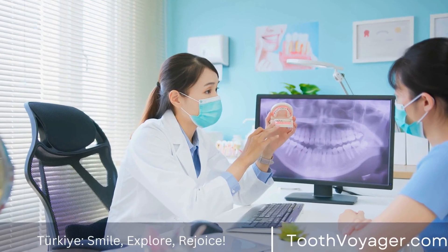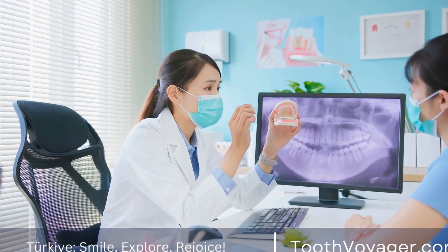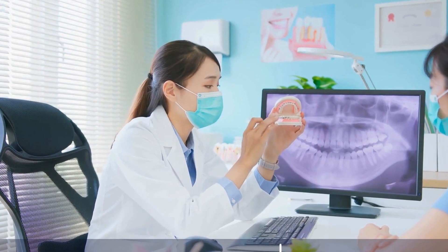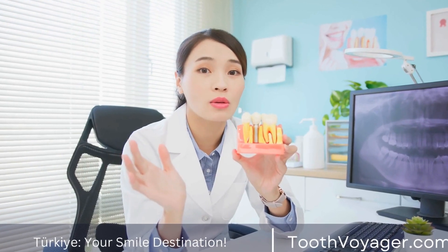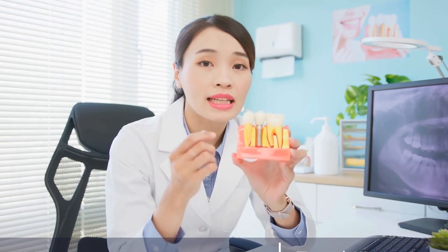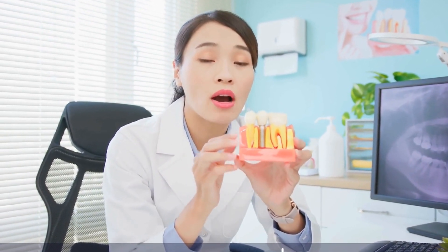The art of crafting dental crowns requires a combination of skill, precision, and the use of high-quality materials. By understanding the materials and techniques used in creating dental crowns, patients can make informed decisions about their dental care and achieve a smile they can be proud of.